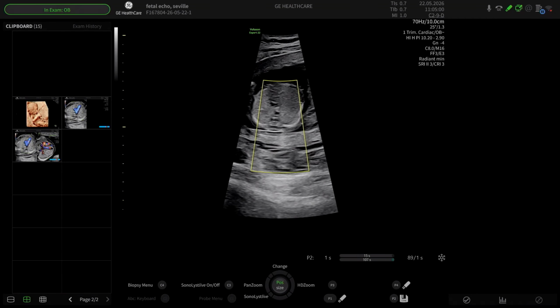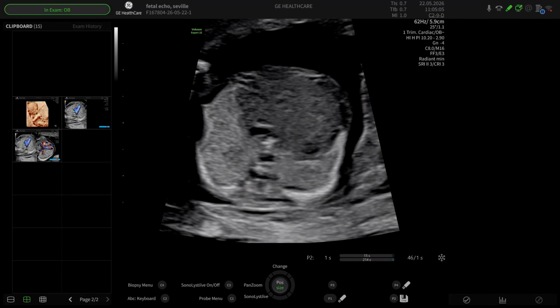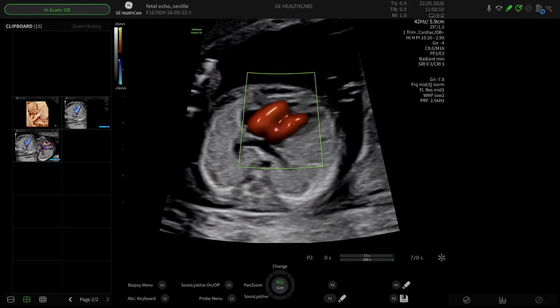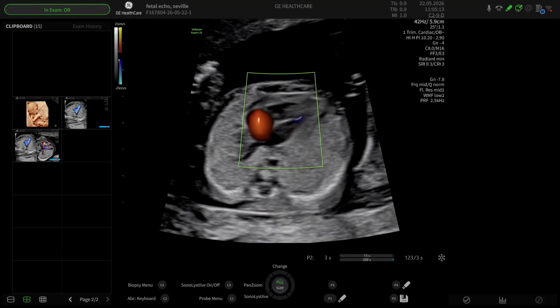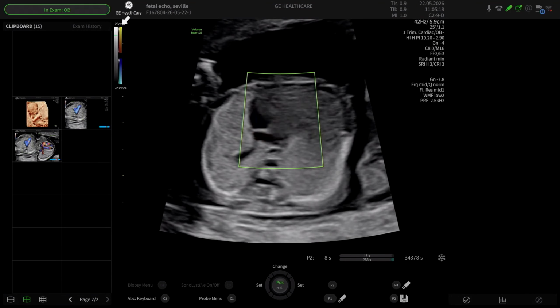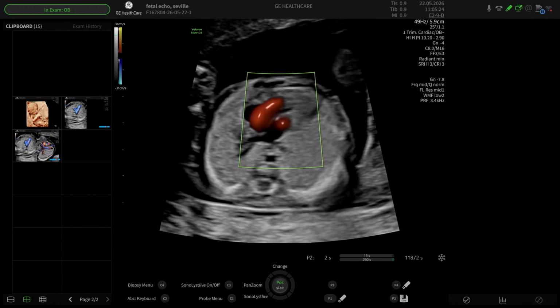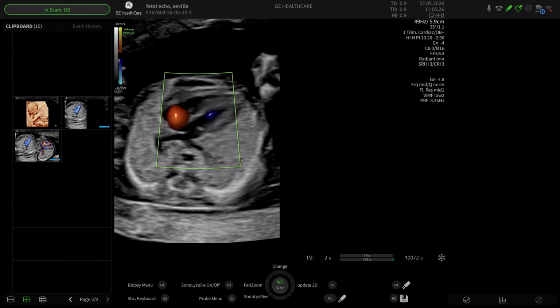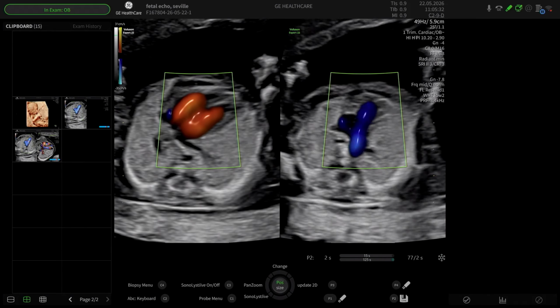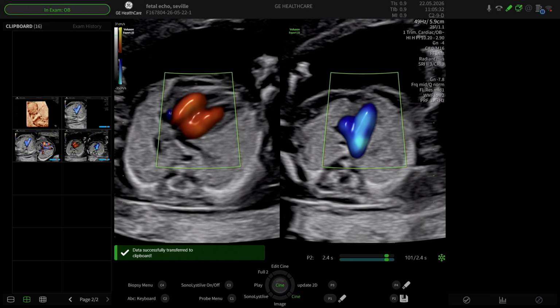I now move to a cardiac preset because this is going to be better for color. When starting off with a color Doppler evaluation, I will start off with color with a PRF, which I've set at 23 centimeters a second. So remember the order I spoke about, start off with the PRF, and I'm going to slightly increase my PRF just to get a cleaner image showing the left ventricular outflow tract. Very quickly, because I don't want to lose it, as part of first trimester screening, and I'll talk about this tomorrow, is to get a 3-vessel tracheal view and a 4-chamber view and save that image to file.